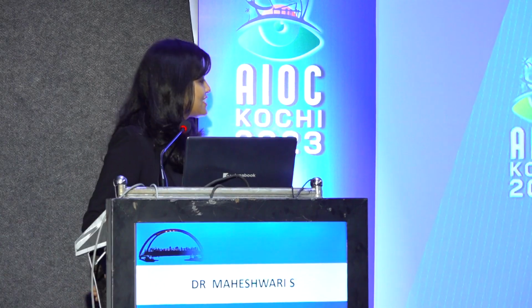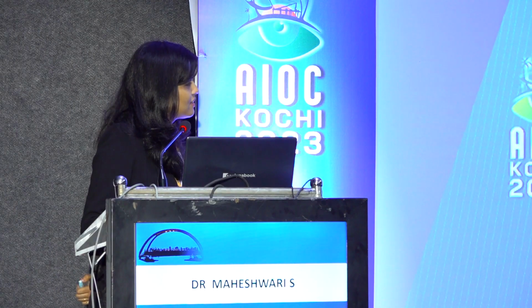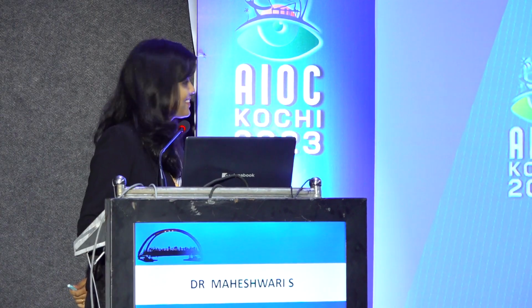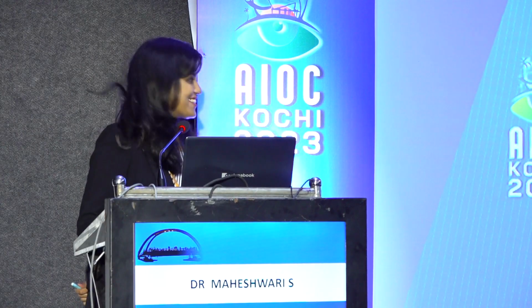Since we are taking partial thickness, I think we are damaging some anatomical structure there. ILM is a part of your surgery. We are adding one more step. I'd offer that the ILM flap is better. Totally, surgeons feel so.